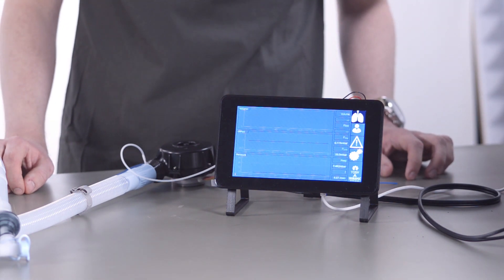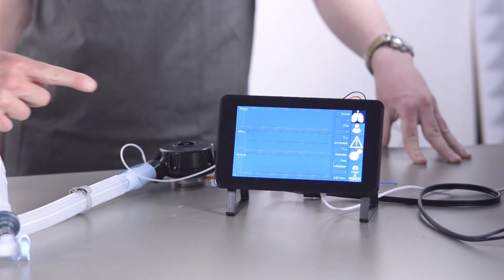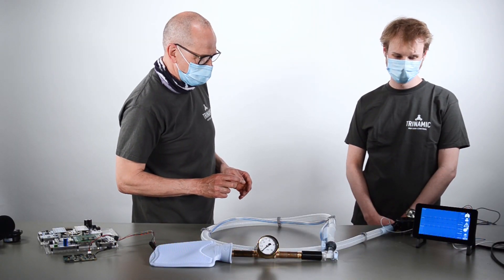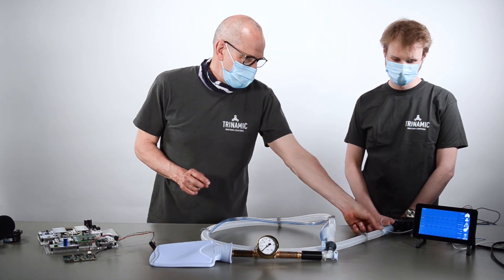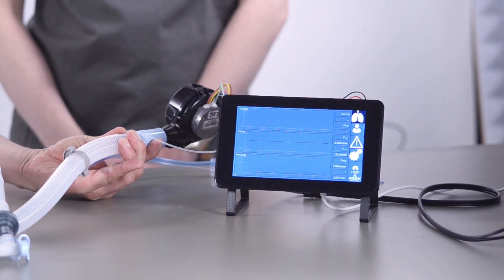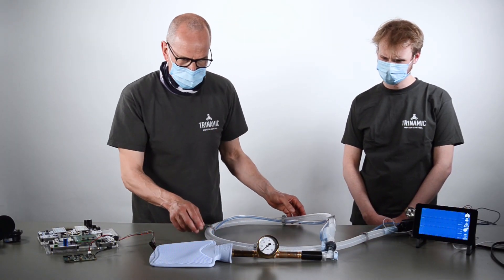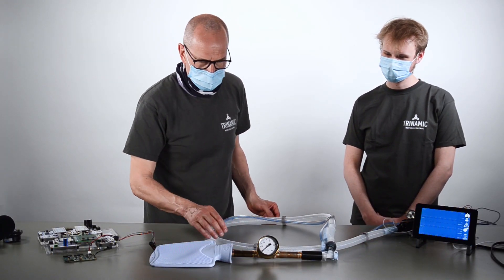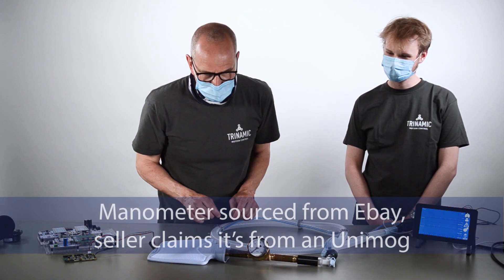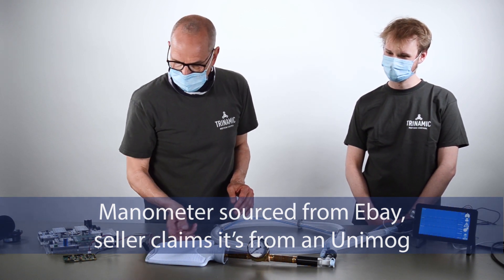Here you see the whole setup, which is basically our setup with the Raspberry Pi and the screen and our TOS V board. You see a blower here — a brushless motor blower — and you see this tube and our steampunk-like pressure control setup, which is basically our lung simulator.